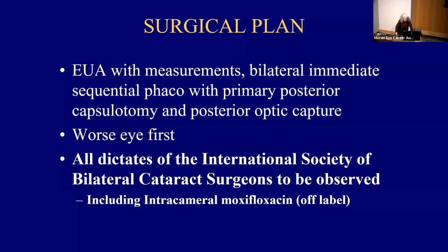All the dictates of the International Society of Bilateral Cataract Surgery were followed. And most particularly, I used intracameral moxifloxacin, Vigamox. Actually, from 2006, I think, is when Arshinoff described it and had 1,000 cases ahead of me. I use it for every case, so I certainly would for any complicated case. And it's necessary, I believe, if you're going to consider a same-day sequential.